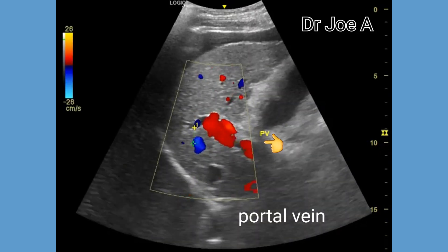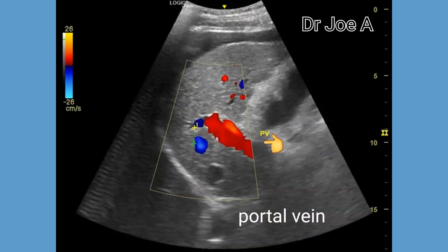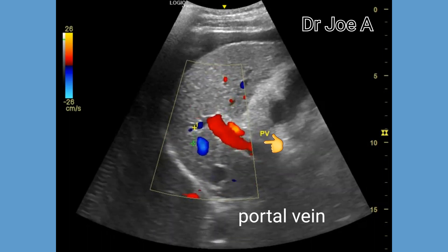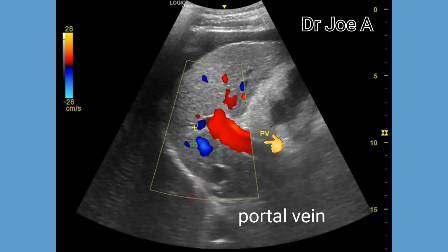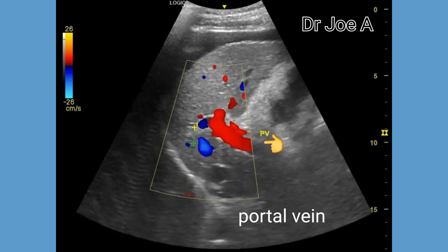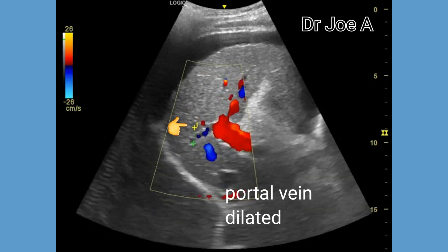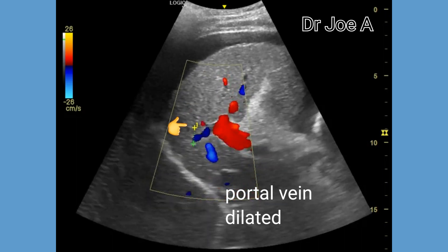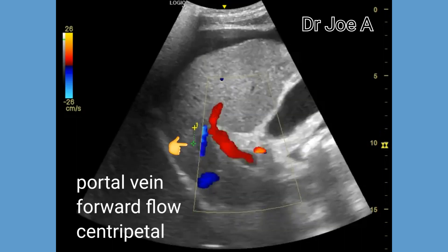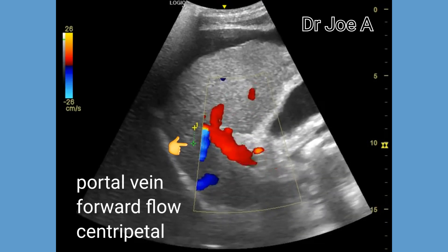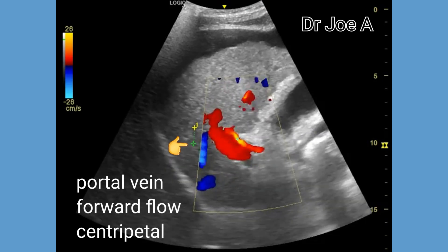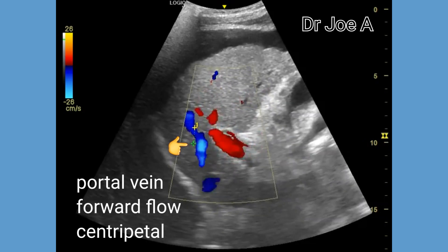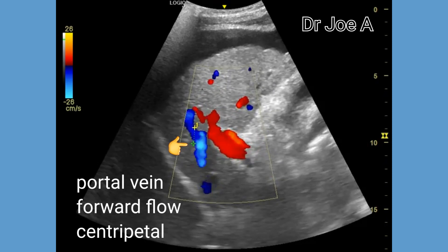Next we come to the portal vein. On color Doppler, the flow in the portal vein appears centripetal — that is, flow towards the liver. This is another good sign. The portal vein, though moderately dilated, does not show reverse flow. Forward or centripetal flow in the portal vein is seen in red color. If the flow were reversed, it would indicate a very poor prognosis for this patient.